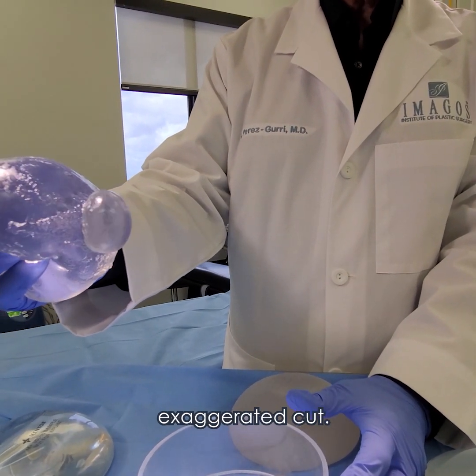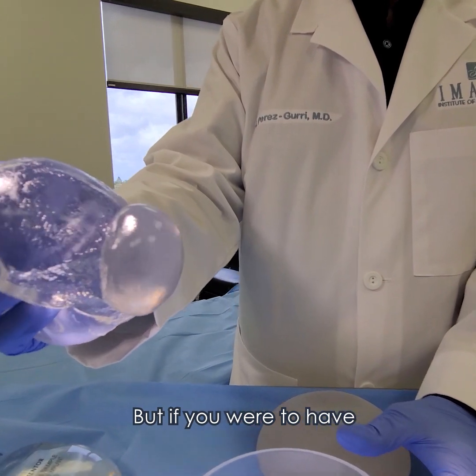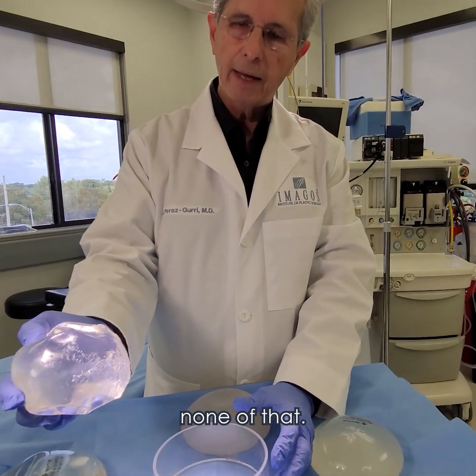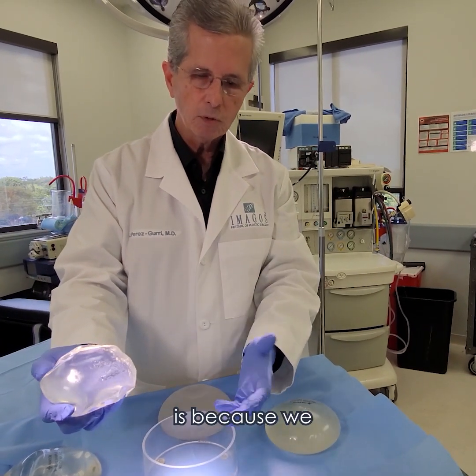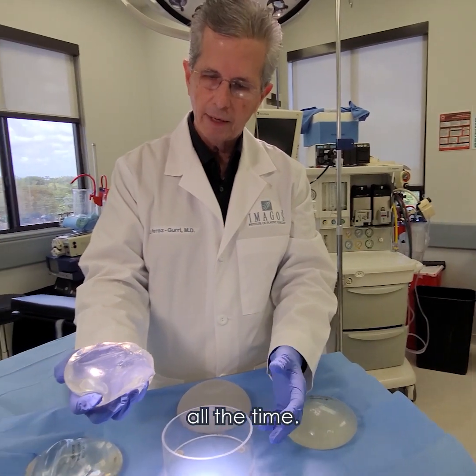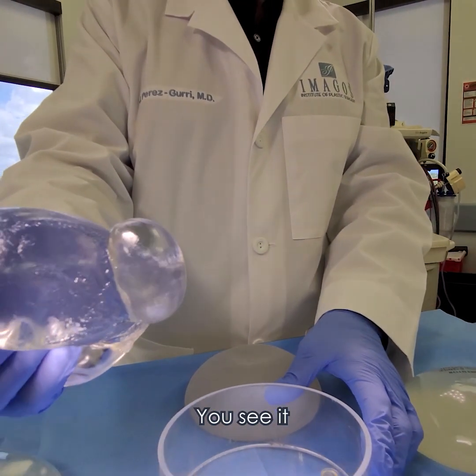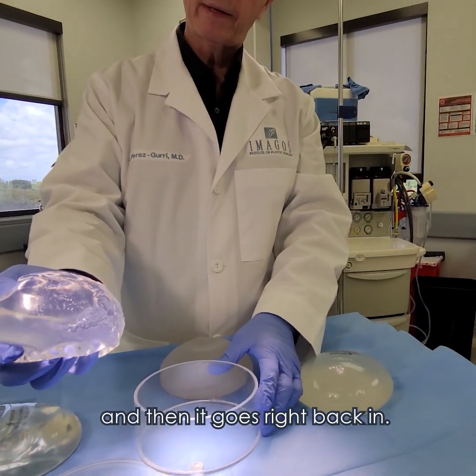This is an exaggerated cut, but if you were to have just a pinpoint cut on that, you can imagine that none of that would escape. The only reason why there's silicone around here is because we demonstrate with this implant all the time, so it's been out for quite a bit. But again, you see that — and then it goes right back in.